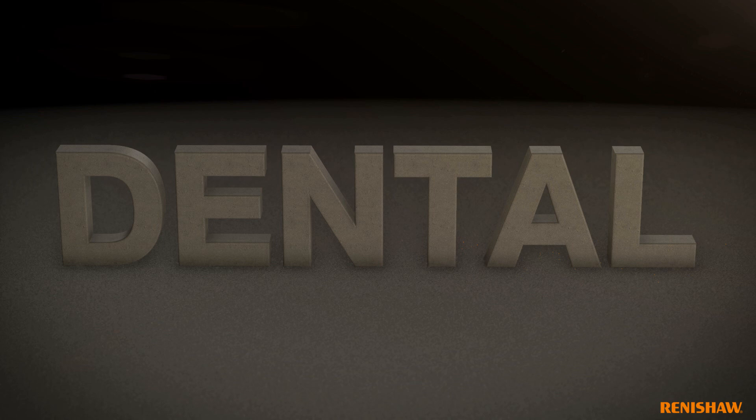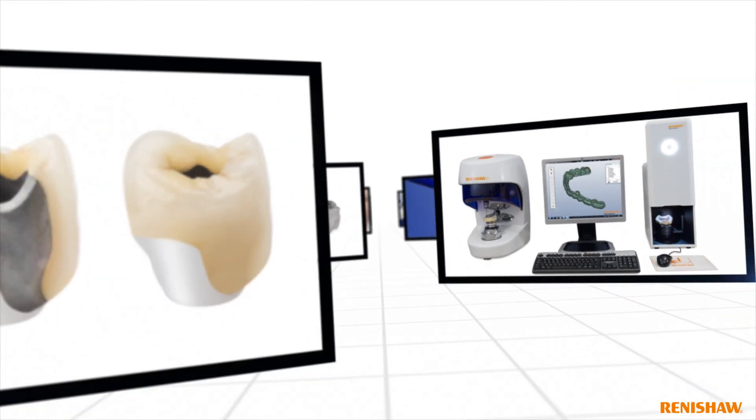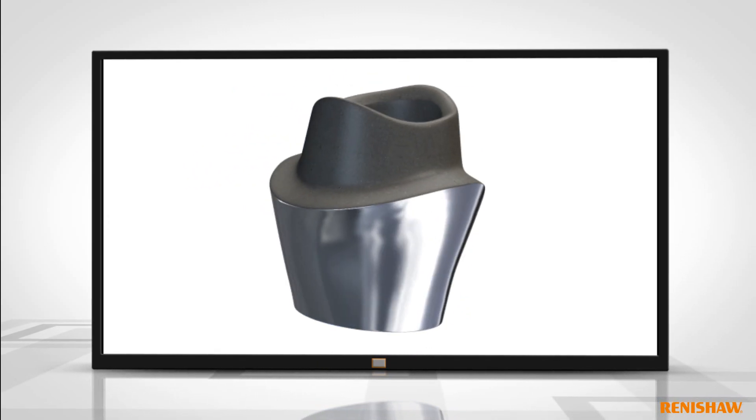Renishaw is developing a range of innovative dental products using the latest advances in 3D metal printing technology. Using digital profile data, Renishaw manufactures bespoke laser abutments to ensure an excellent fit.